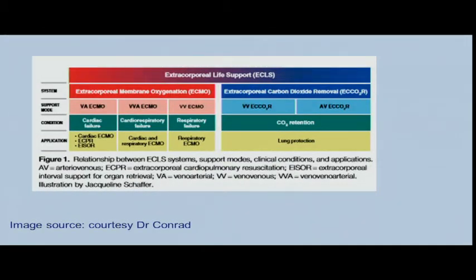Before I delve into ECMO, well, my presentation is on ECMO, but I met with Dr. Conrad and I was able to understand the overview of what ECMO is all about. If you look at this, this is an overview. It's not just ECMO alone, but we have other devices. So we have the extracorporeal life support, which includes the ECMO and the ECCO2R. The ECMO is extracorporeal membrane oxygenation, and the ECCO2R is extracorporeal carbon dioxide removal.